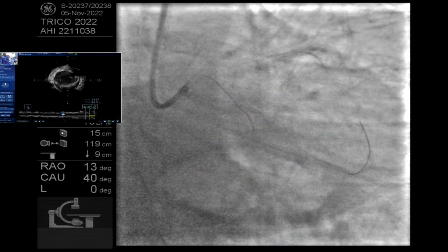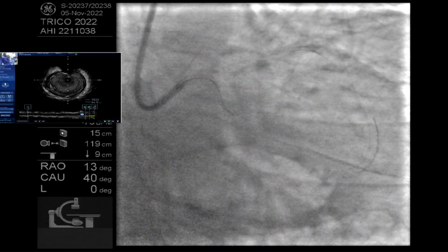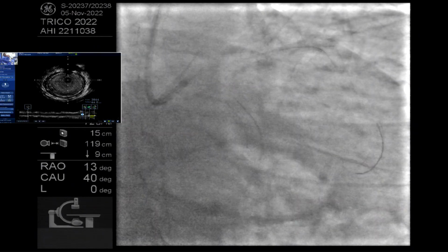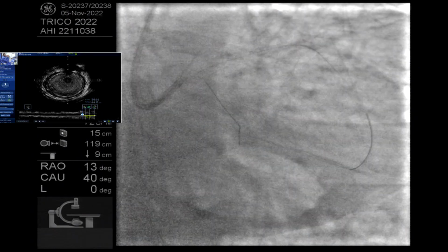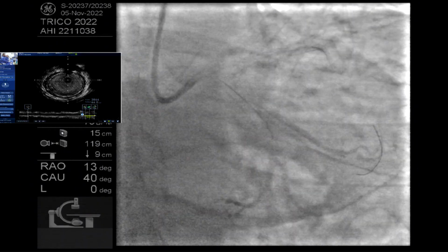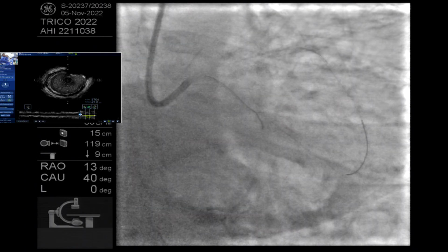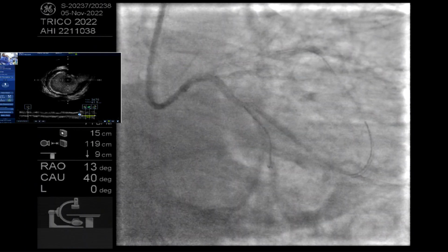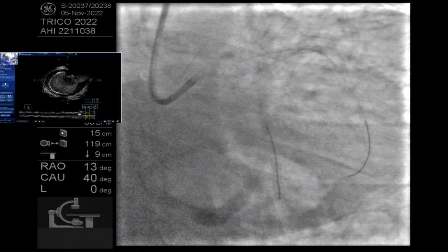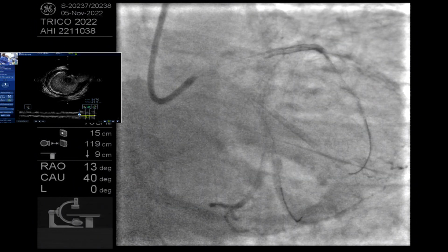But already broken at the tip. I can never control the tip direction. Right there, yep. I think you're in. Broken, but you still got through, that's amazing.